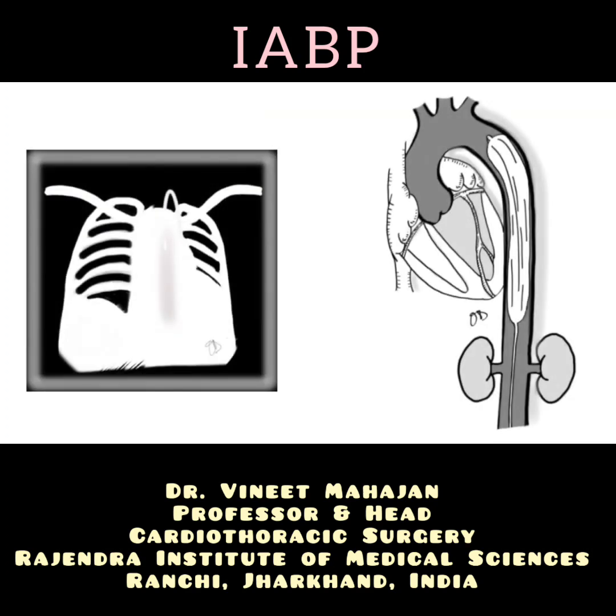The intra-aortic balloon pump is positioned in the descending aorta, either percutaneously or surgically. Ideally, the tip of the intra-aortic balloon pump should be 2 cm below the origin of the left subclavian artery and the distal end above the renal arteries. On the chest X-ray, these landmarks can be approximated by assuring that the tip of the balloon pump is seen at or slightly above the level of the carina, between the second and third intercostal space, and at least 2 cm below the aortic knob.